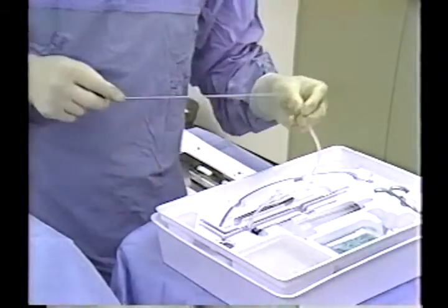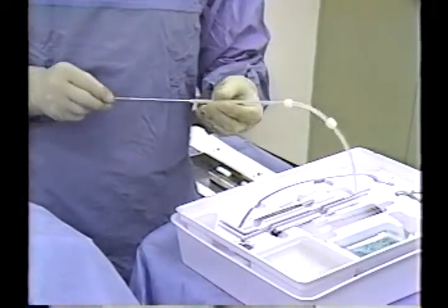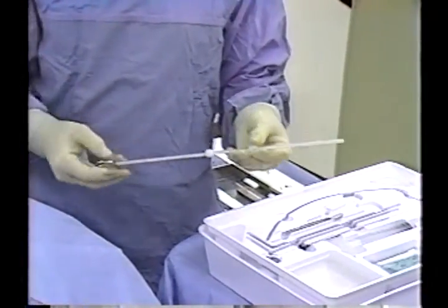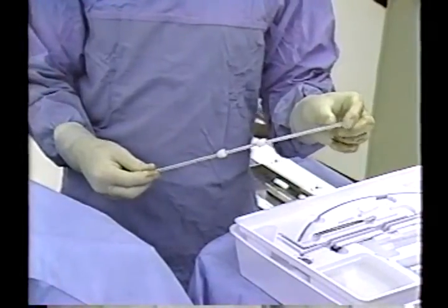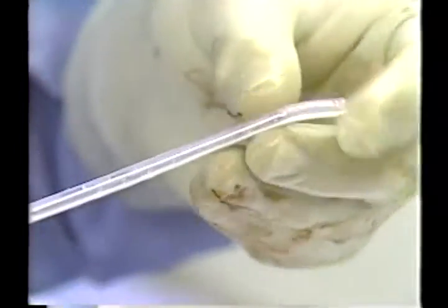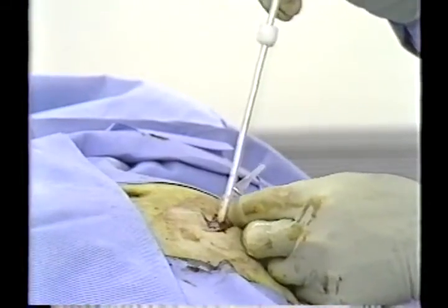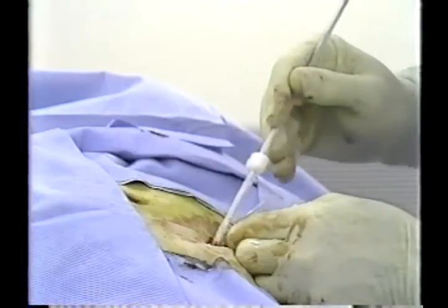The stainless steel stylet is inserted into the pre-soaked catheter. This will make the catheter rigid enough to insert it within the quill catheter guide. The stylet comes to approximately 1 inch of the catheter distal tip and will not protrude from the catheter when compression of the catheter is made. The catheter is then advanced into the abdomen through the quill catheter guide.